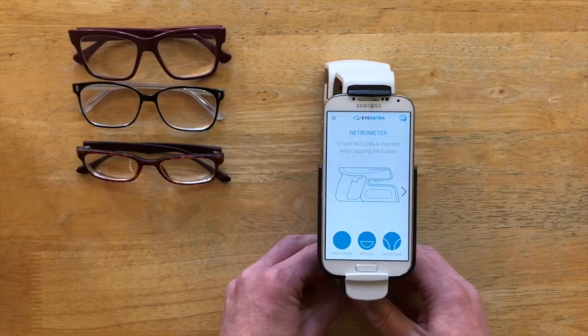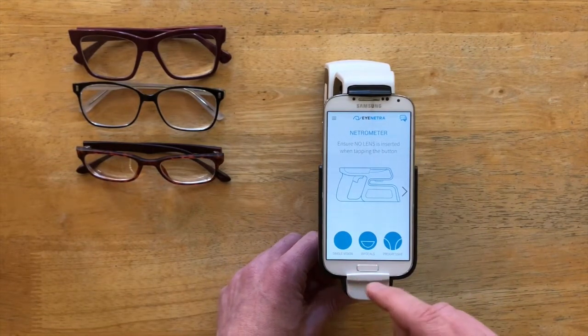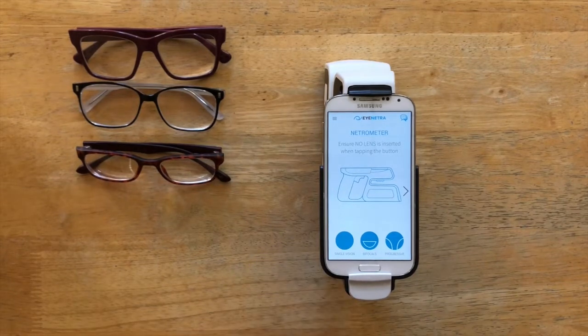Now you'll notice we have three modes here, one for single vision, one for bifocals, and one for progressive glasses. So let's begin with single vision.